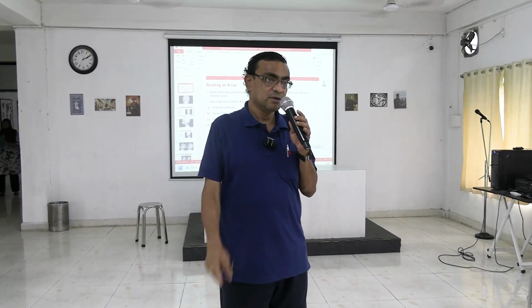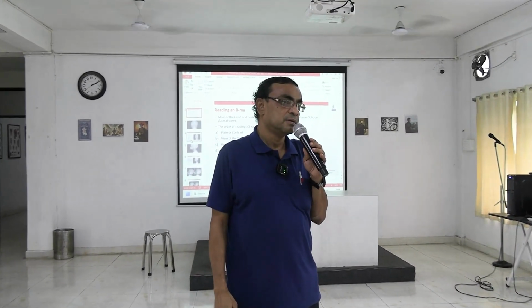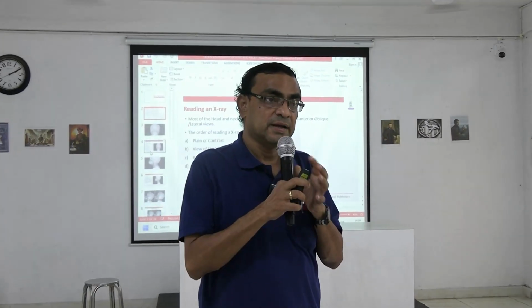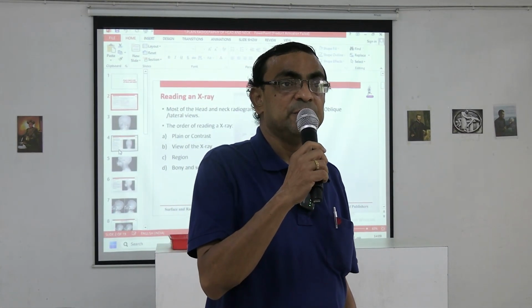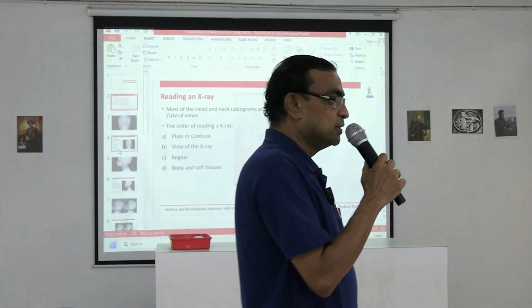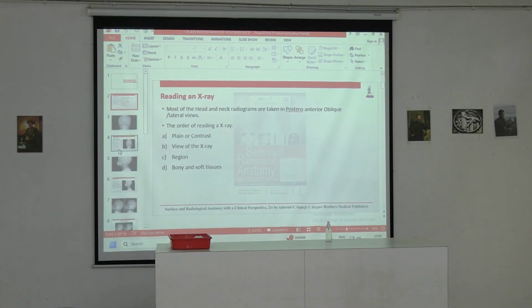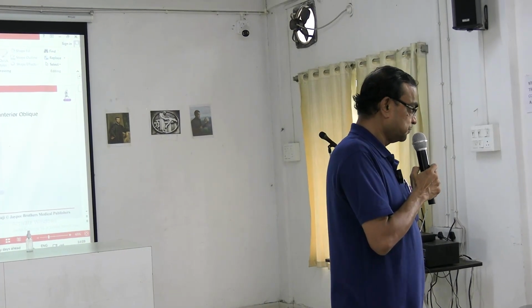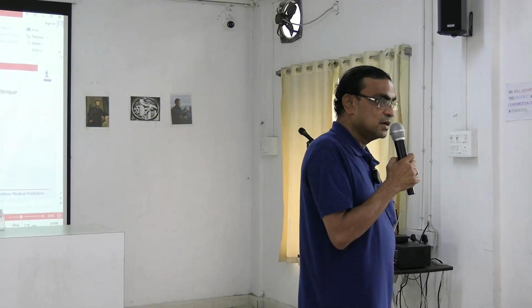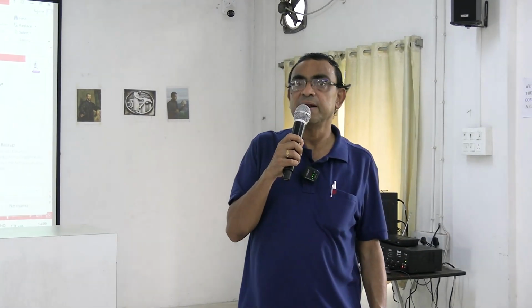Today's topic is radiology of the head neck region. There are several types of radiological images. Some are plain radiological images. Some are contrast radiological images. Contrast images and plain images like plain X-ray.